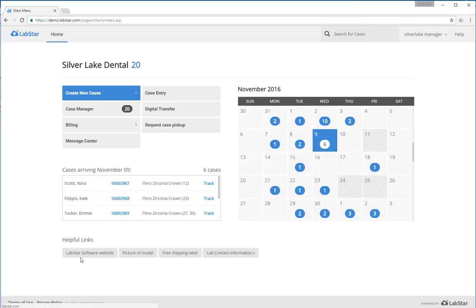Finally, there's some helpful links down at the bottom left. This is information provided by your lab so you can have better communication and they can provide you better service.